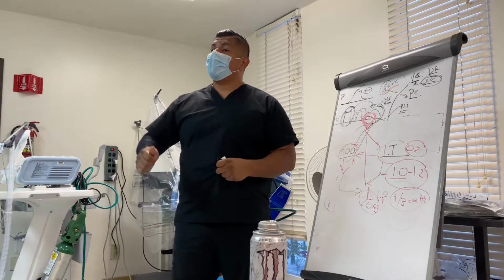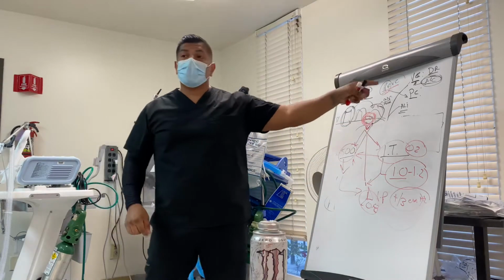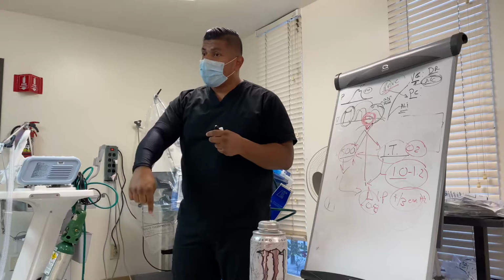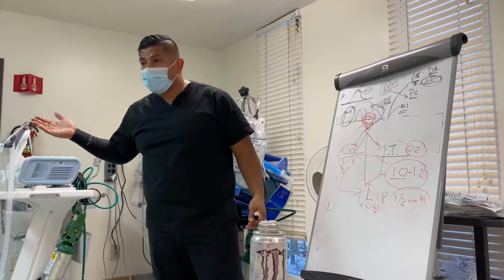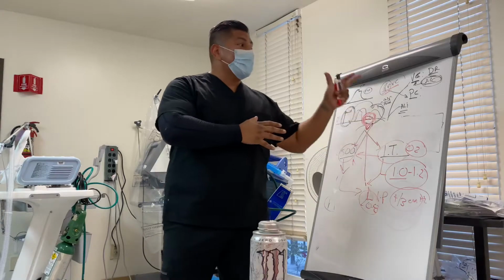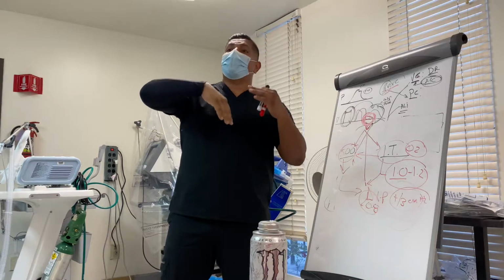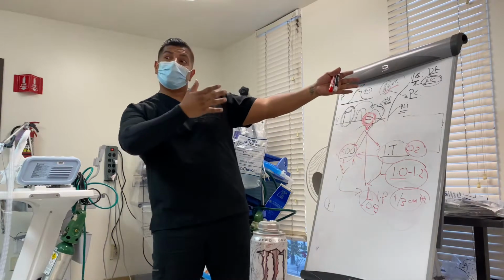And what is the problem with septic patients? Their blood pressure. The blood pressure tanks. So if you have regular volume control, you are going to decrease their cardiac output. Too much intrathoracic pressure will then cause venous return to drop. The nurses are going to be giving them drips like crazy, and all that water has to go somewhere. Where's it going to go? To the lungs. So if we choose a mode that can automatically adjust inspiratory pressure, because when we adjust the time, we adjust the flow, right? So the less of the flow, the less of the pressure, right?